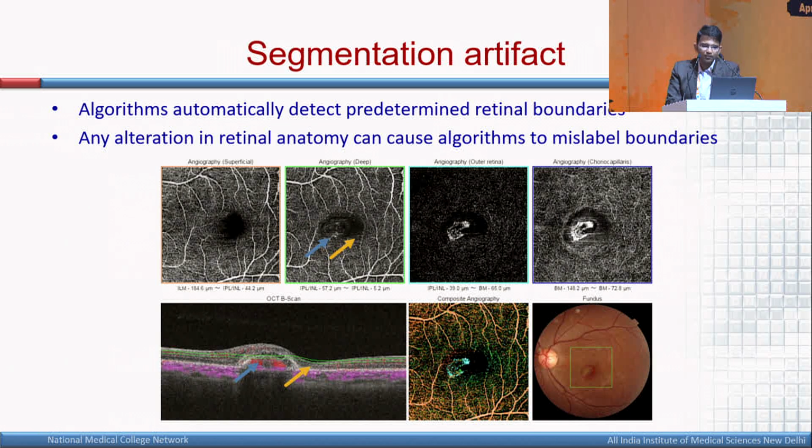which is there in the choriocapillaries at the sub-RPE level. But because of the hump, if you see the green lines, which denote the slab of the deep plexus, you see that it is going above this hump, going through the hump, and adjacent, as the yellow area shows, it is going in the pre-retinal area. Because of that pre-retinal area, you're getting a flow void in the middle picture over here. This is the flow void that is happening because of the slab going anterior to the retina.